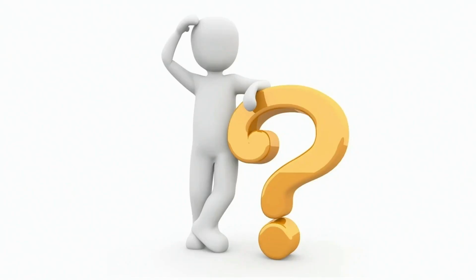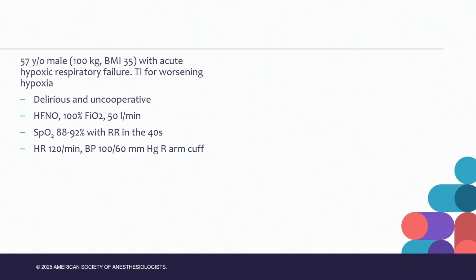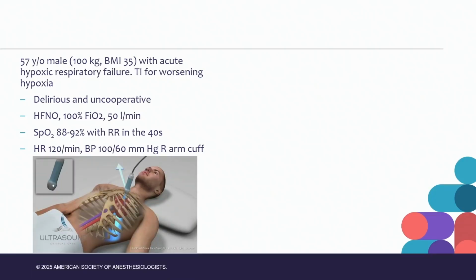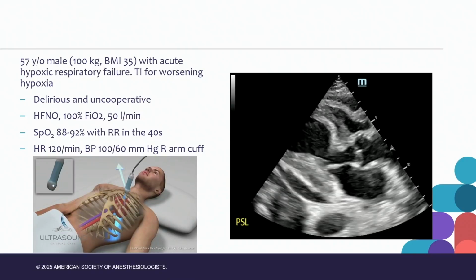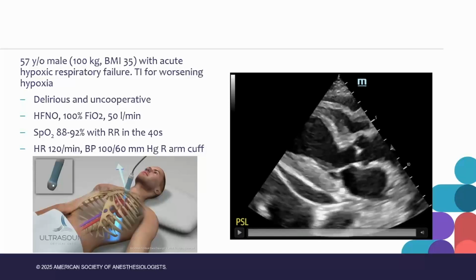So let's look at some clinical examples. Let's start with the hemodynamic example. We'll talk about the same patient or a similar patient. All these patients have kind of the same physiology. So this is the patient that you've been called to intubate, right? You go in, you put in the POCUS probe and see this in your parasternal long axis view. Now, as Rachel had talked about, that right ventricle is collapsing. This is cardiac tamponade, right?